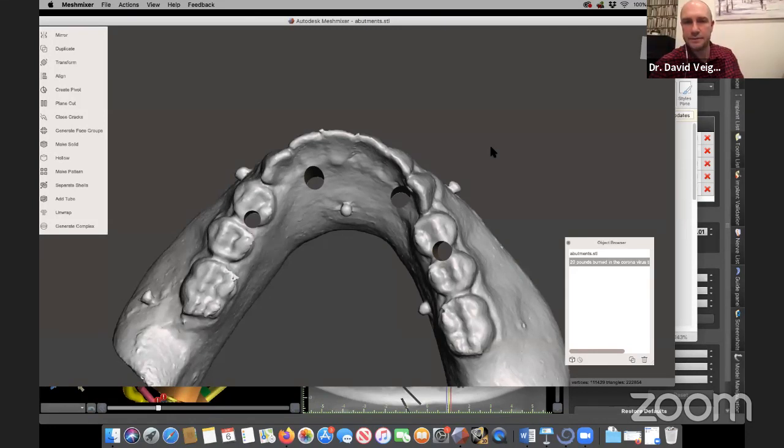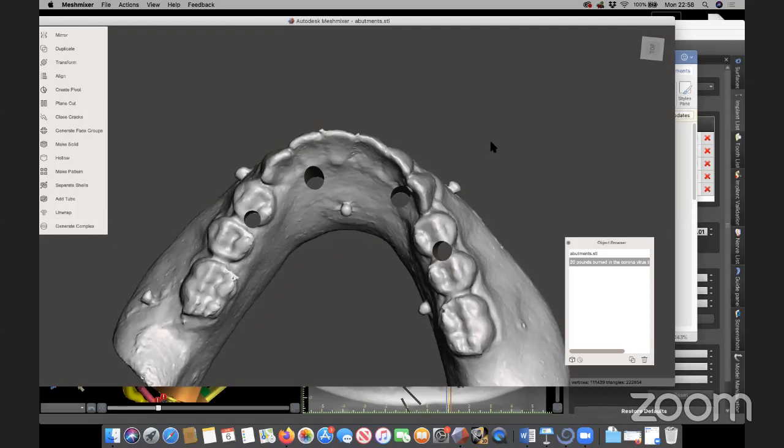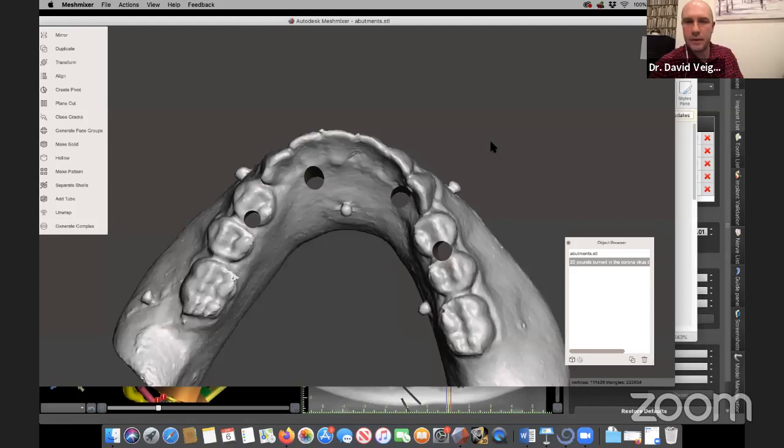Let's see here. Okay, maybe one more. Yeah, sure. Try to pick a relatively straightforward one. We got some.